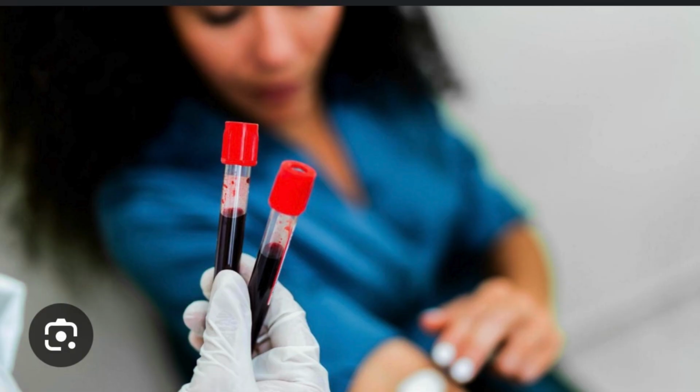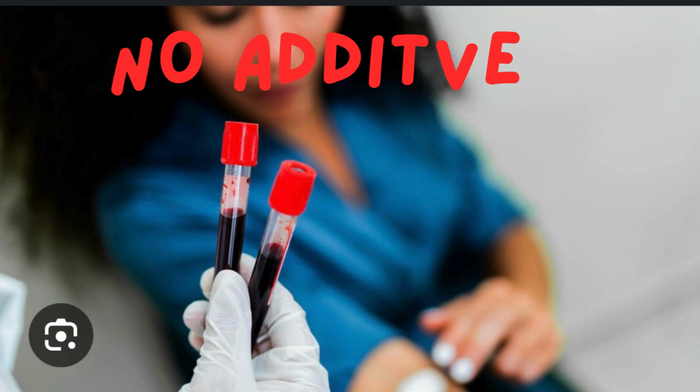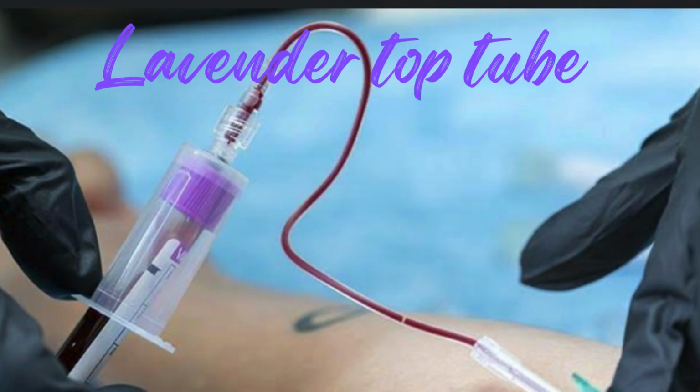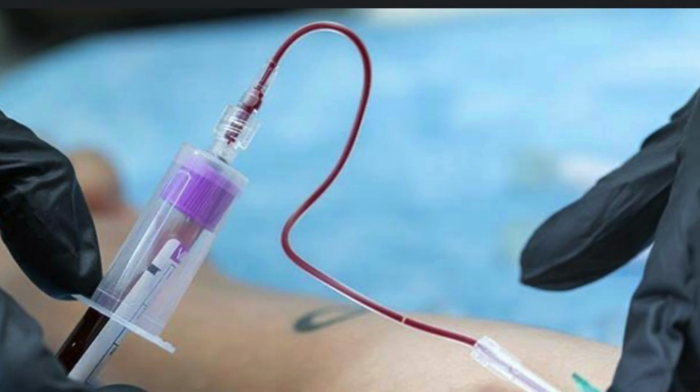We're going to move on to the purple top tube. Purple top tubes, also known as lavender top tubes, contain EDTA as an anticoagulant. They are primarily used for hematology tests such as the CBC, a complete blood count, to prevent blood from clotting.